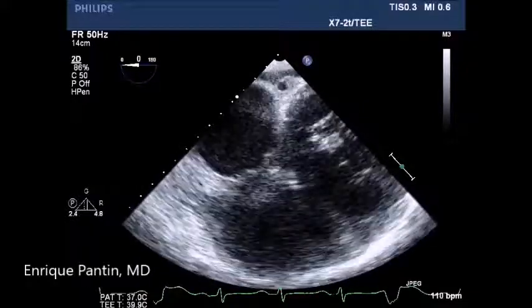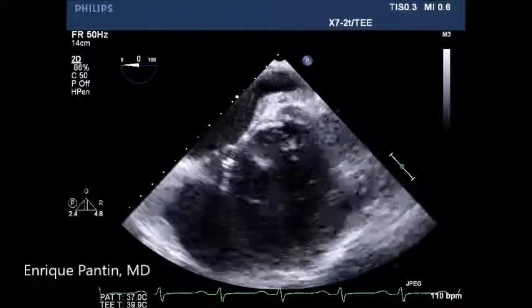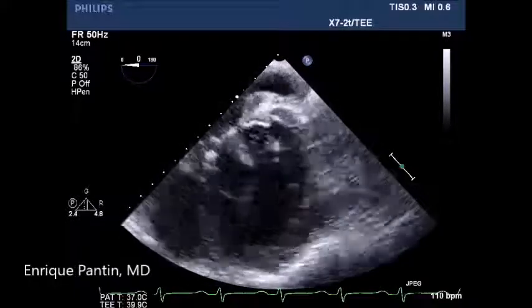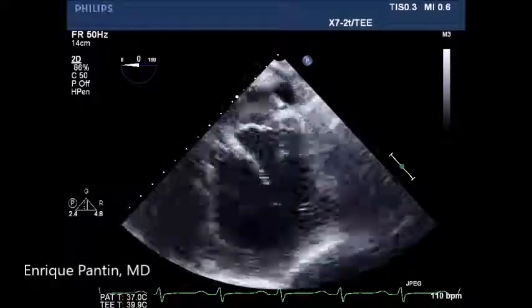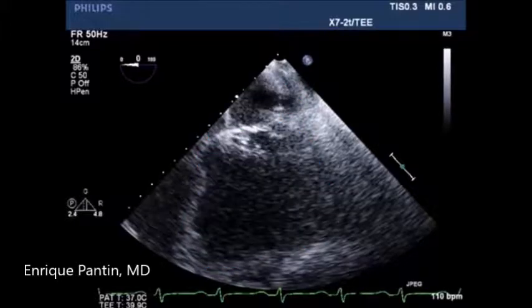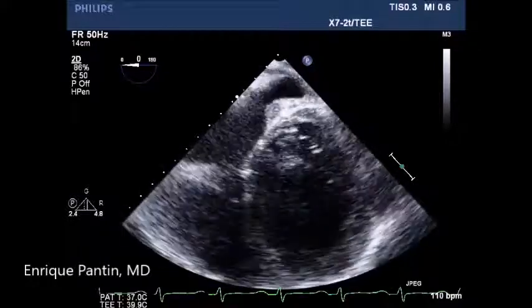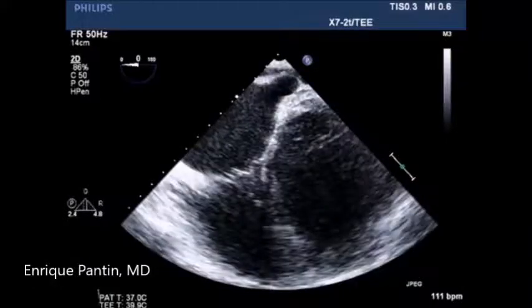The probe is then pulled out and the middle cardiac vein drains into the coronary sinus. The probe is turned to the left — you can see the distal coronary sinus in the red circle, with the left atrium and left ventricle noted.